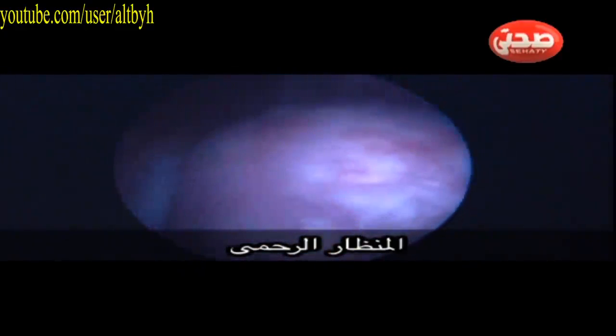You can see here the hyperplastic endometrium in this postmenopausal patient. It's also important practice to look systematically at the other parts of the uterus, as you can see.